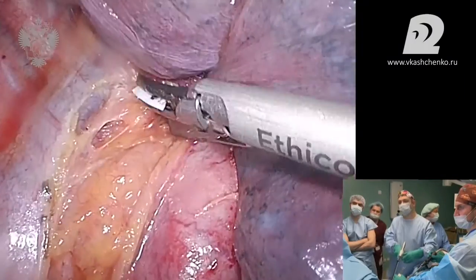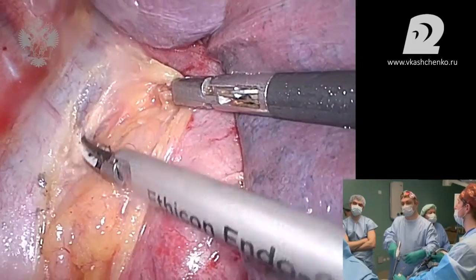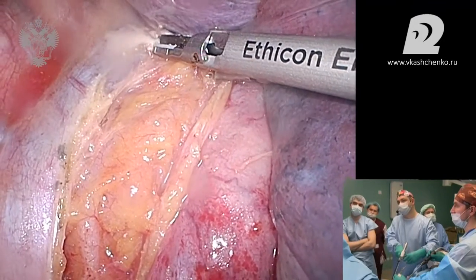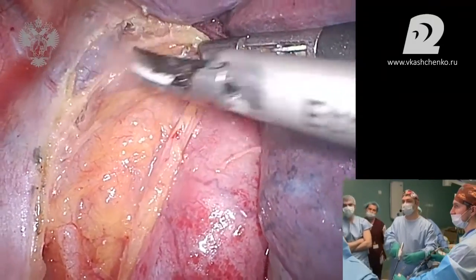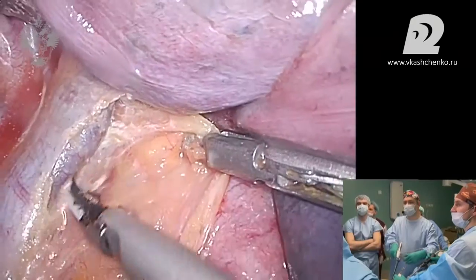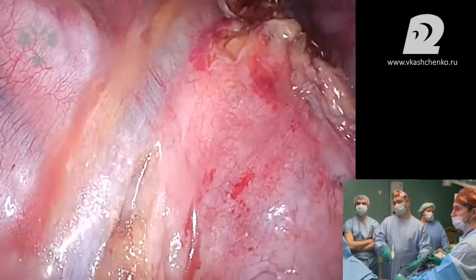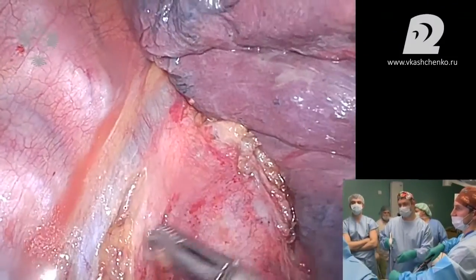How many lymphatic nodes are seen by the morphologist after laparoscopic removal? If it's Sergei Vorobyov, then 25, 30 nodes, usually he finds them. We actually have an average number, it's 14. When it's distal, when it's esophageal, of course, the number is high because dissection is wide. Let's do a long dissection along the vena azygos. Clamps do not work properly.